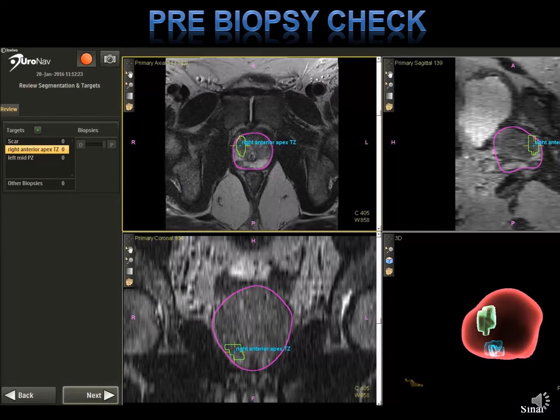This is the first screen — I call this a pre-biopsy check. Once you've started your biopsy procedure, on the left you have your region of targets. In this case, we have a scar marked by the radiologist, a right anterior transition zone lesion, and a left mid-peripheral zone lesion. What's important on this screen: the first thing is to click this red button. This is the record button — it will keep track of everything that goes on during the procedure. If there's any discordant pathology, you can always go back and review what happened.